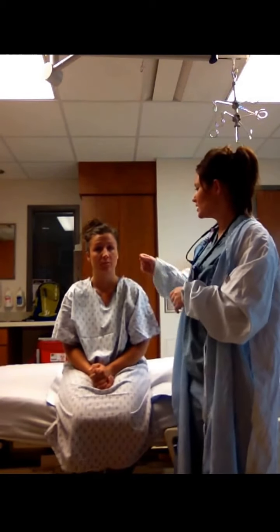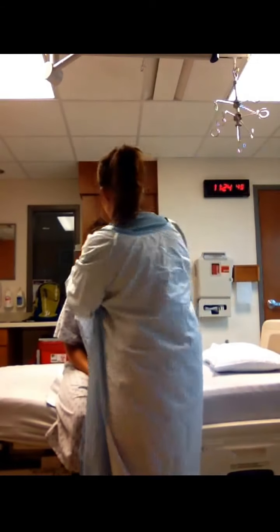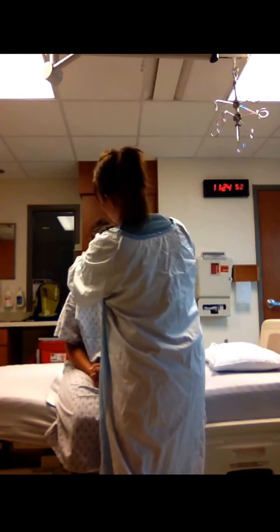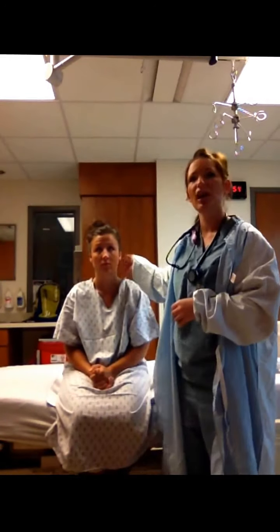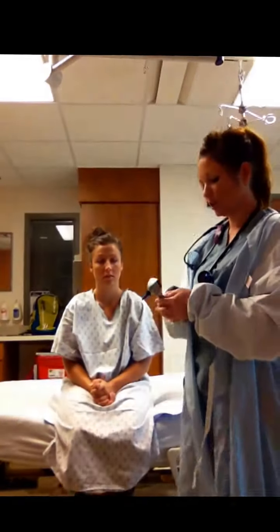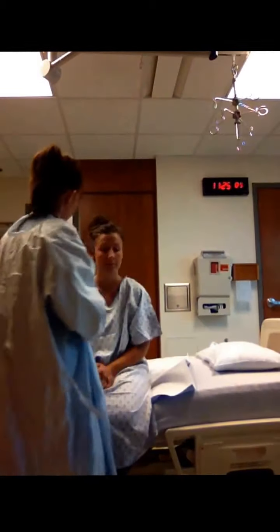So we will move on to Courtney's ears. I'm going to inspect them on the outside visually. Courtney has normal sized ears. They are equal, they are symmetrical. I'm going to now look into Courtney's ears with the otoscope and look at her tympanic membrane or her eardrum. So in order to do this, I'll get on this side.